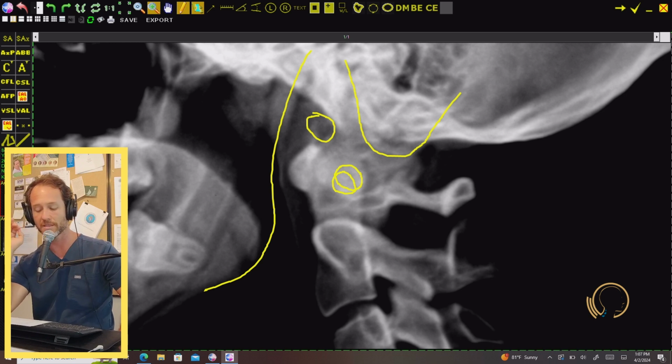Only after this step is taken can an Orthogonal doctor properly align the instrument to deliver a precise adjustment. Failing to perform this essential step will result in the administering of an inaccurate adjustment. Serious negative outcomes may occur, including the patient not clearing, not holding, or the subluxation worsening, like I mentioned, right?